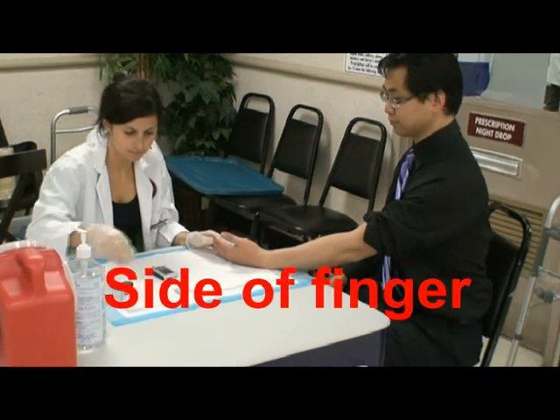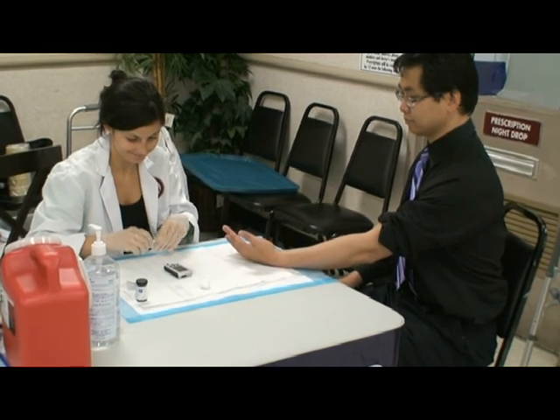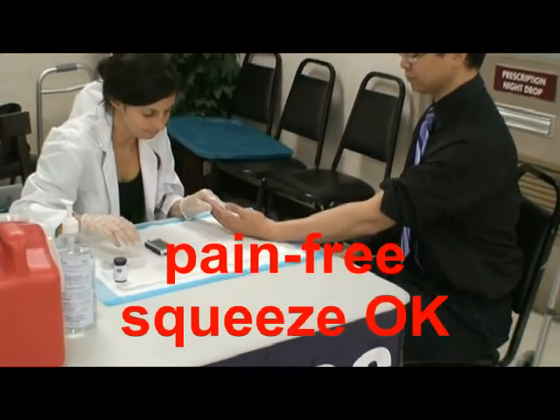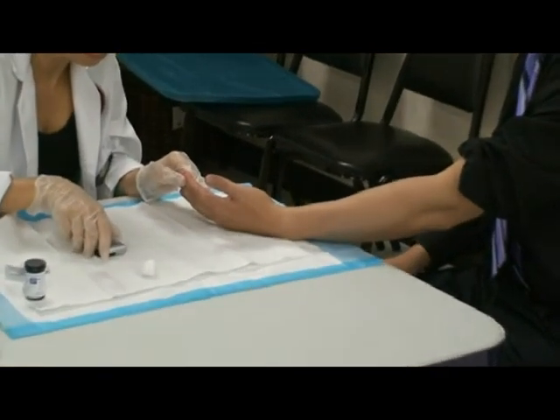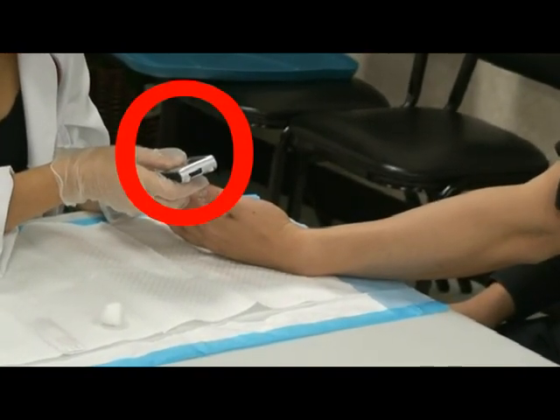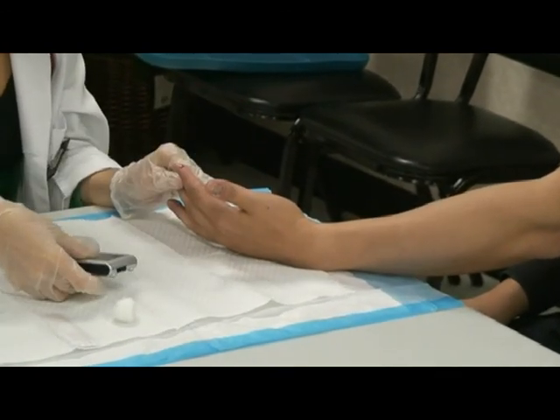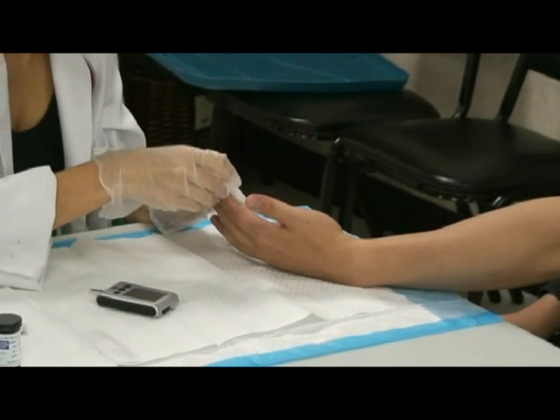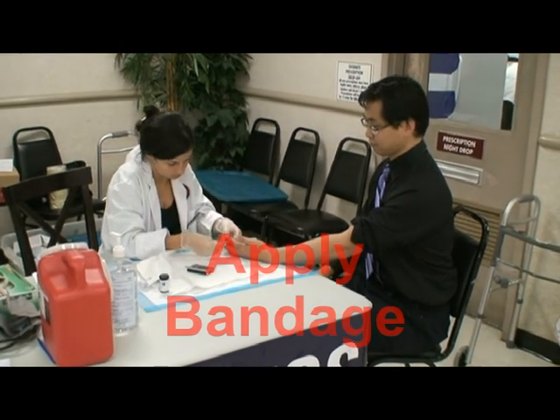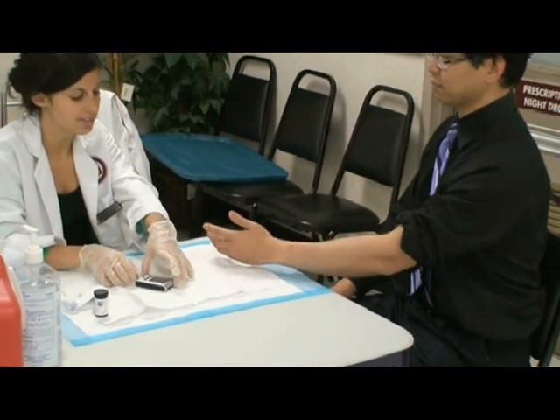We want to make sure that we prick on the side of the finger because that is less painful for the patient. And don't be afraid to squeeze to get the amount of blood you need. When testing with the test strip, make sure to place it at an angle of 45 degrees to get the accurate reading. Great, your blood sugar is 86.